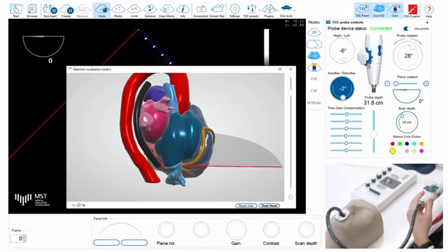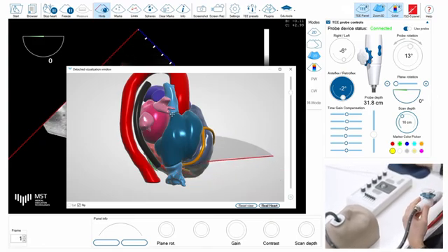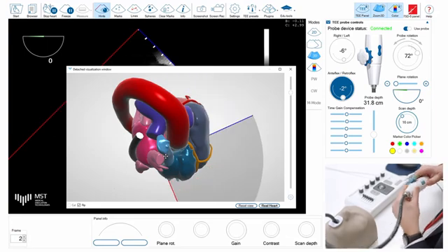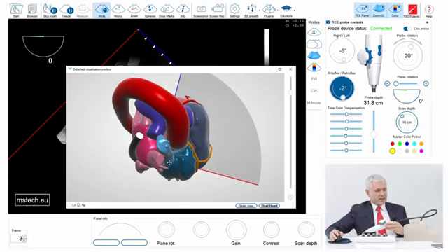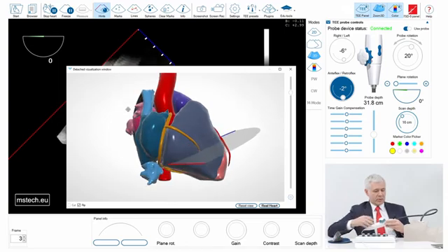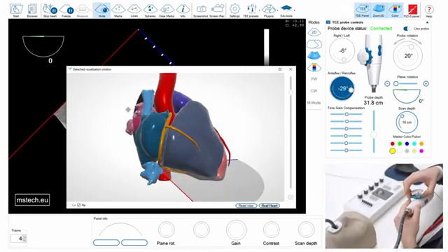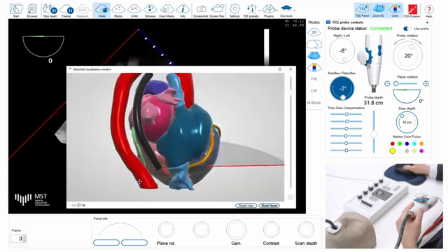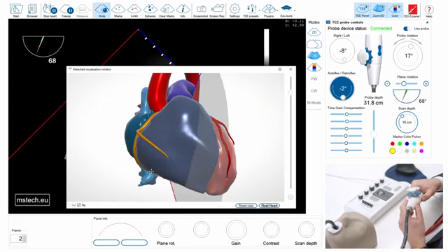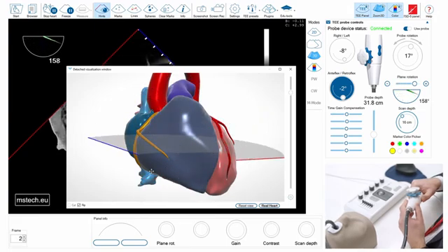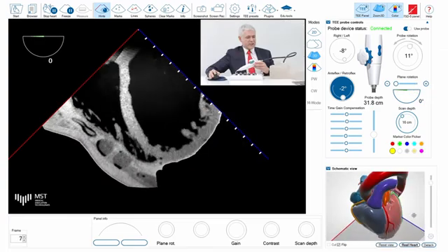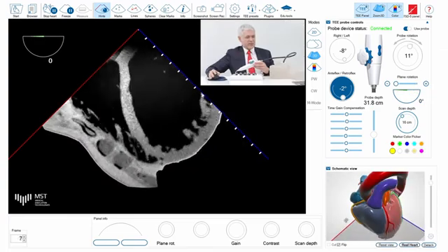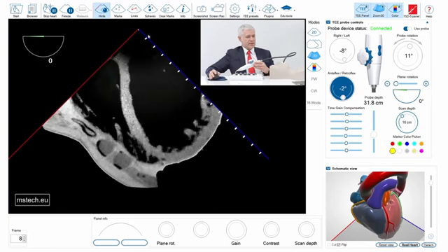I can also show rotation of the probe in degrees — here you can see how I rotate clockwise or counterclockwise. I can also flex the probe anteriorly or posteriorly as well as right or left. I can change the angle of the projection from 0 to 180 degrees. Both sides of the sector are marked with a blue and a red line, which is also visible on the main screen.